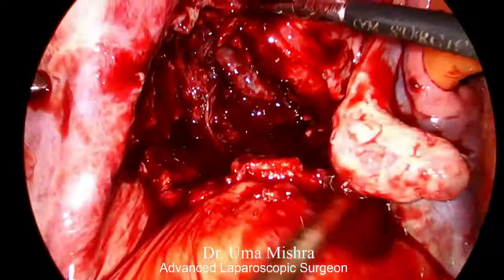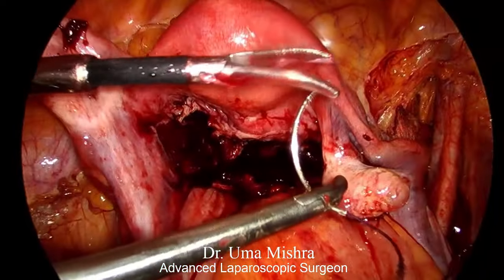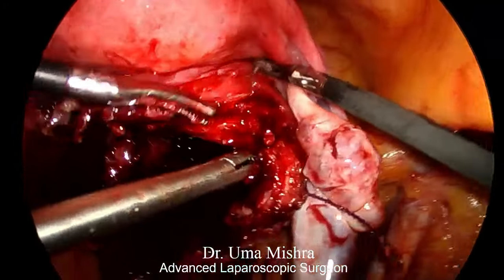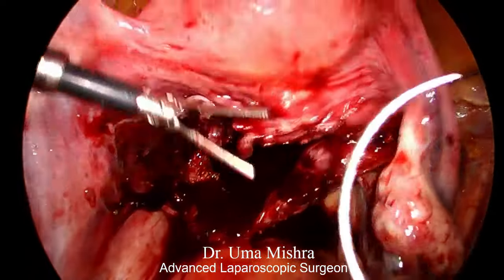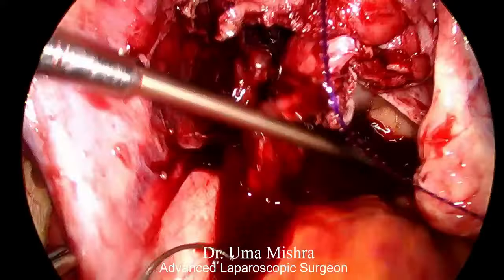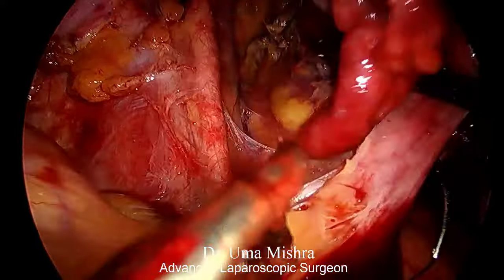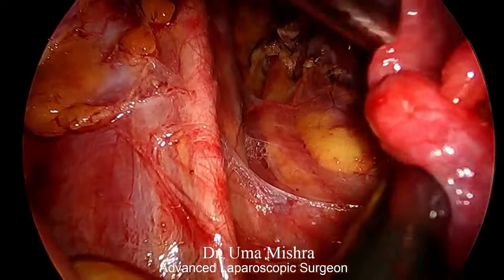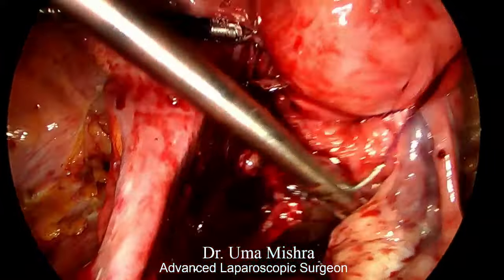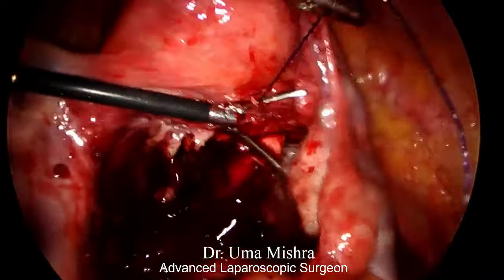So we suction all the blood and clot and we perform suturing with barb suture. The barb is ideal material because we don't have to take knots, that is the system of knotless suturing, and tissue gets tightened with equal tension at every point. So we start suturing from one end to another. The double layered suturing is performed in a continuous fashion. So also keep on suctioning in between all the clots and bleeder and looking for the position of ureter.